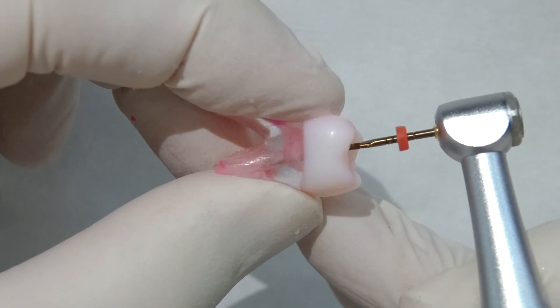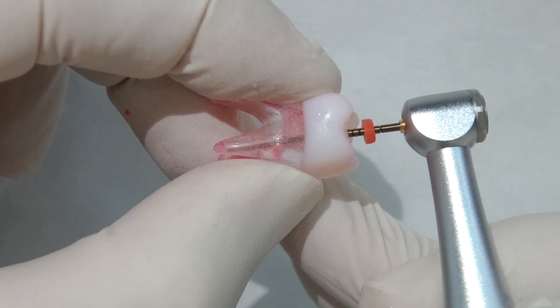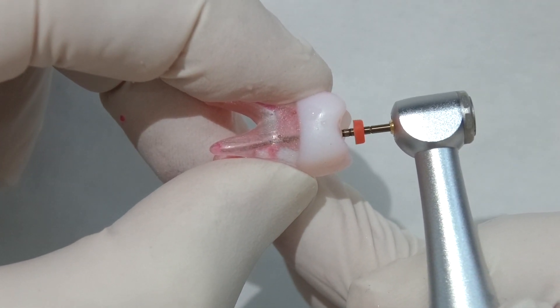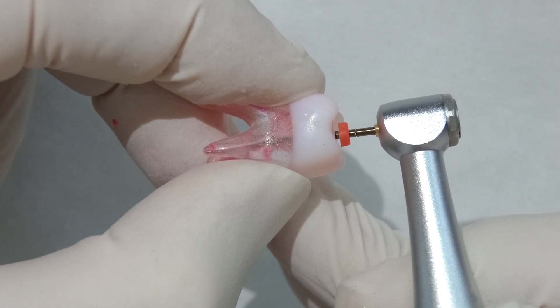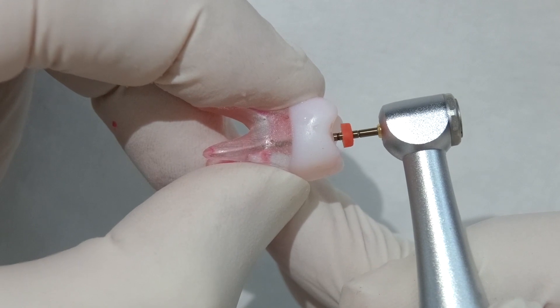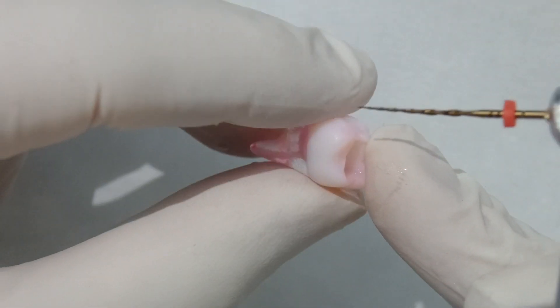These files that we have, it's a really lovely alloy. It allows us to put a bit of a bend in it. So they're nice and flexible, but you'll sometimes see it kind of wobbles around a little bit because it will maintain a bend. And we're just progressing that really nicely all the way down to our working length. And that hit that beautifully.